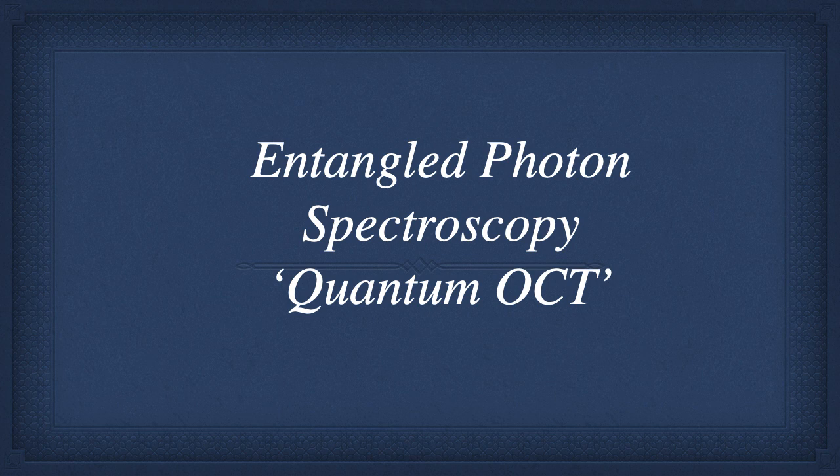And you see this all the time, and it somewhat drives me crazy. If this is quantum OCT, then anything that uses light is basically quantum OCT. So with OCT, you're using one detector; when that light comes back, it's an interference into one detector. That's first order correlations.